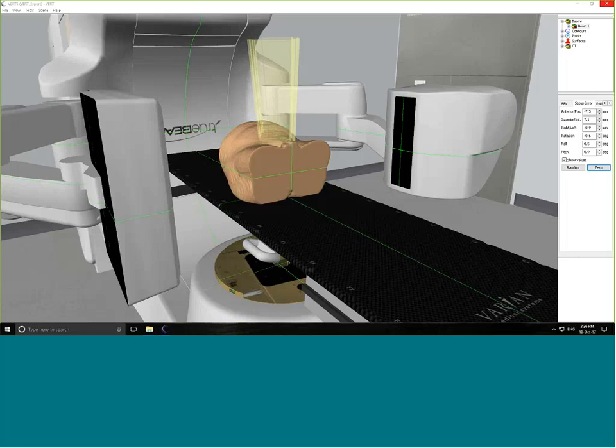Yeah, I thought I'd just mention that. Sorry, it's okay. I was going to say we don't actually have a measurement tool, but it is a good idea, and I'll feed that through.